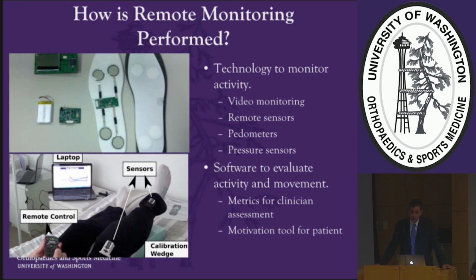All of this information is able to be integrated into an interface that the clinician is able to see to provide their evaluation. In addition, this interface is also available to the patient so that they have an idea themselves of how they're doing as they're performing their exercises. As an example, if a patient is working on range of motion exercises, they are able to see right in front of them what the range of motion is, as well as get an idea as to where they are compared to where they should be, which can be used as a motivational tool.